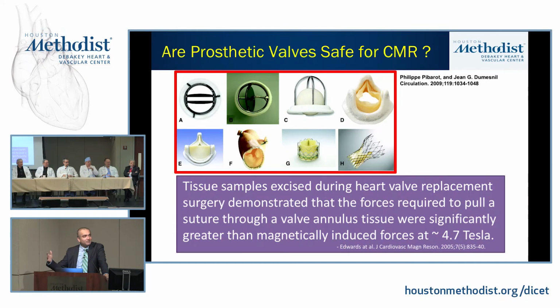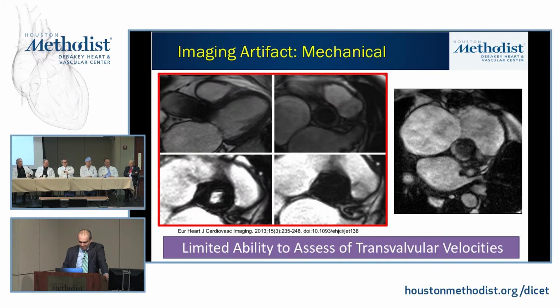And it's about 4.7 Tesla. So right now, clinically, we use 1.5 or 3T scanners. So until we get our 7 Tesla scanner, I don't think this is going to be an issue. So most of these valves are safe to image. So I think that's the first thing I want to address.